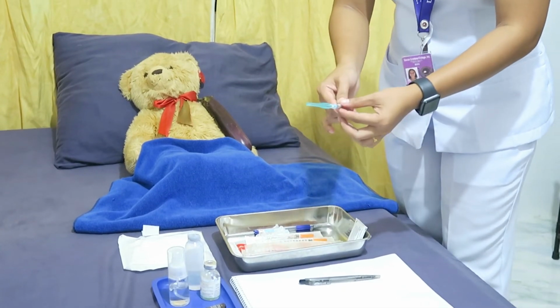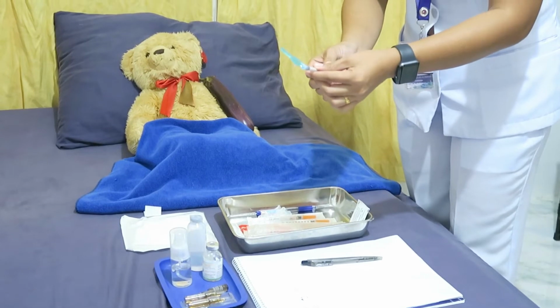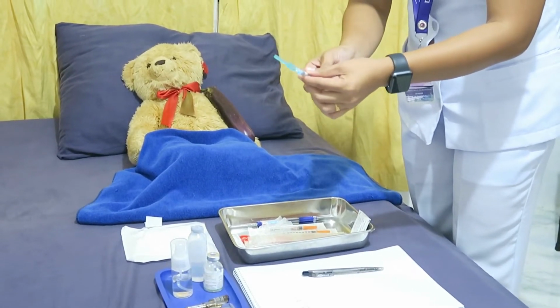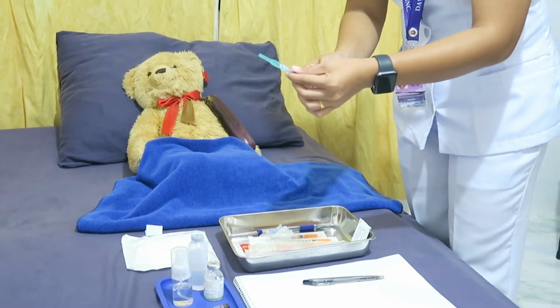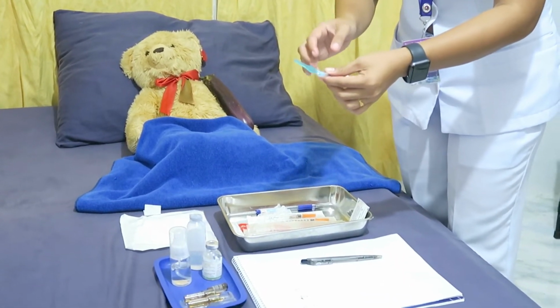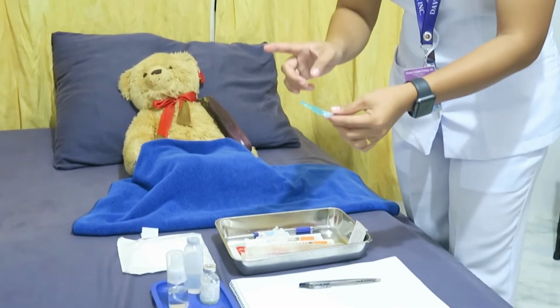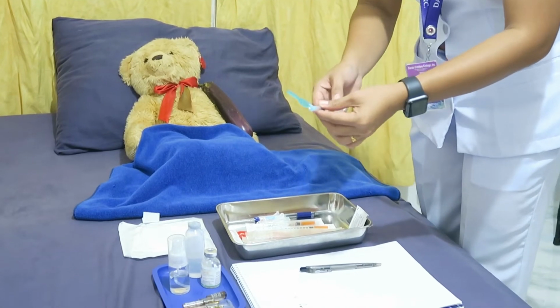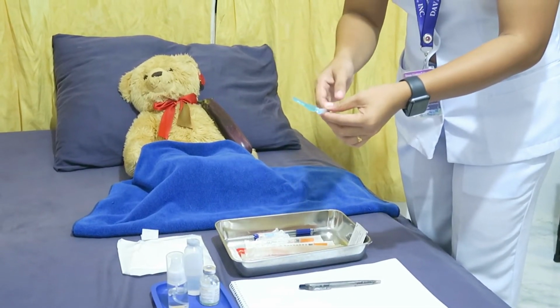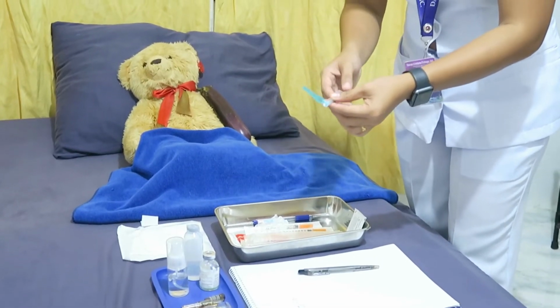And then, carefully, we need to draw up into the syringe the amount of air. After that, carefully insert the needle into the upright vial through the center of the rubber cap, maintaining the sterility of the needle. After that, inject the air into the vial, keeping the bevel of the needle above the surface of the medication.